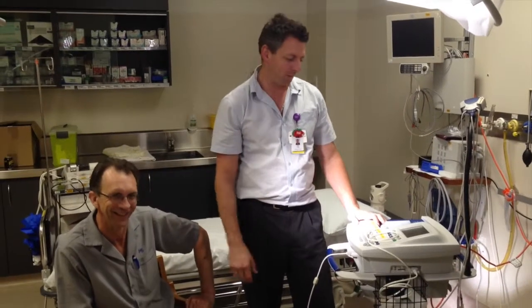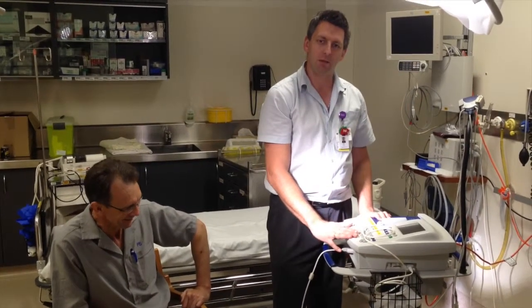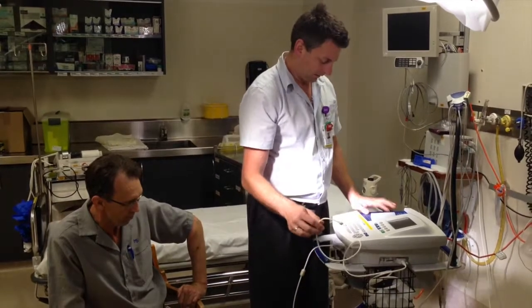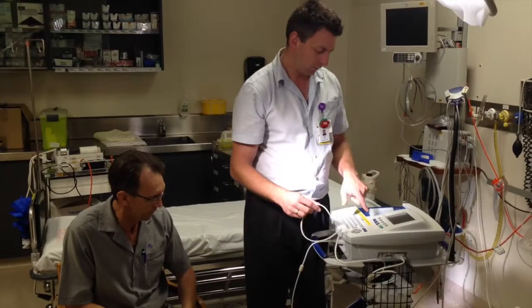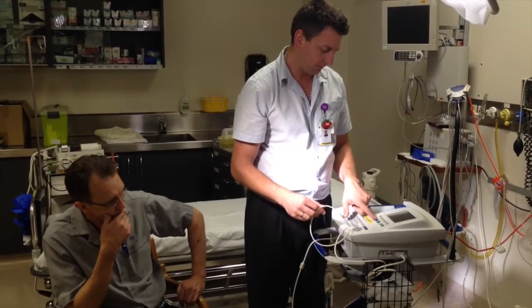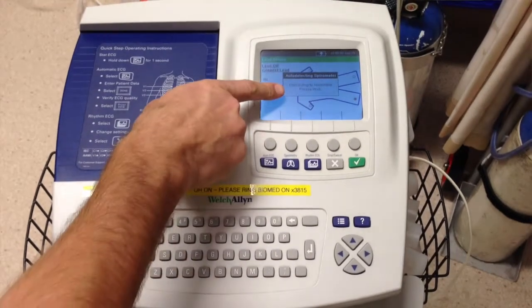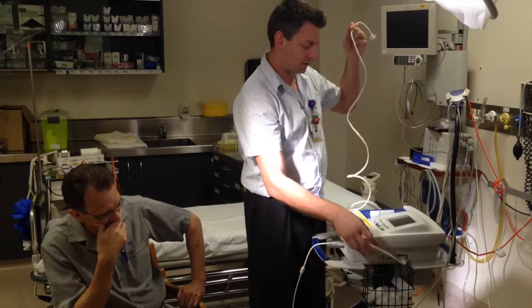We're using the Welch Allyn machine. We have two machines in the department, so the first one I'll try is the Welch Allyn and get it going. First we turn it on with the on/off button, give it a second to warm up. It has five buttons and it's got a set alone so you can't miss it. Press spirometry and then it does a self-test — just make sure it has the tubing attached to it.